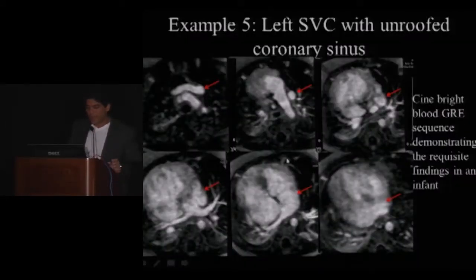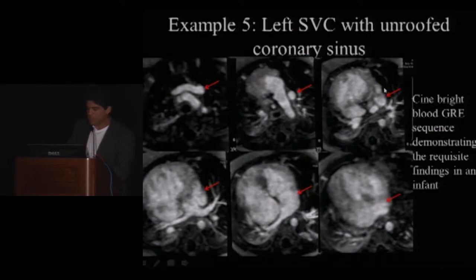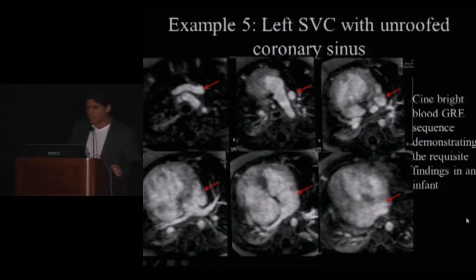Another example involves a left-sided SVC. On the Cine Bright Blood GRE sequence, it demonstrates the requisite findings where the left-sided SVC opens into the left atrium. This is an unroofed coronary sinus, and the technique demonstrates the anatomy very well.